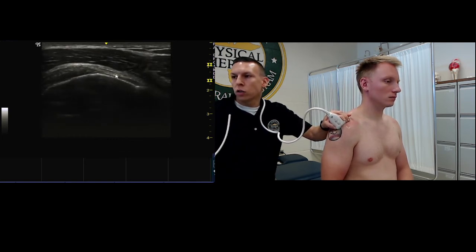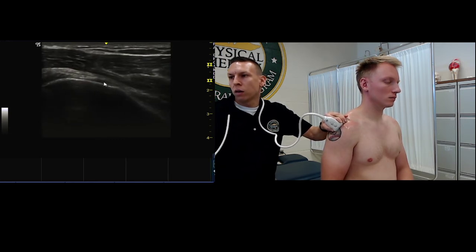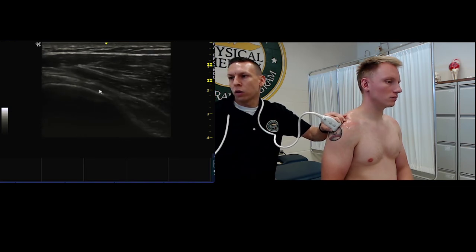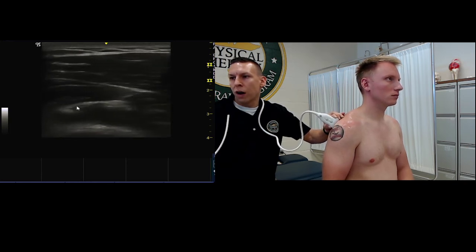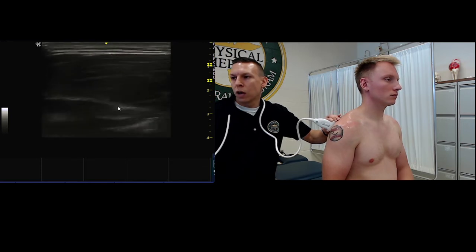If you want to, you can look for the teres minor, which is this structure right here. It's a little harder to visualize here. It's a much smaller tendon. But if you want to identify it, we can do the same trick we did for the infraspinatus, where we found this bundle of connective tissue, and we came down below.